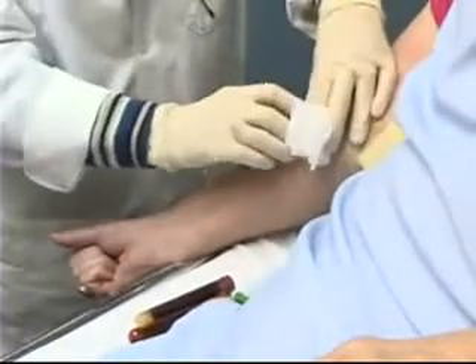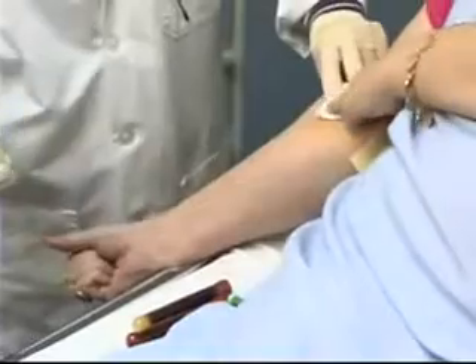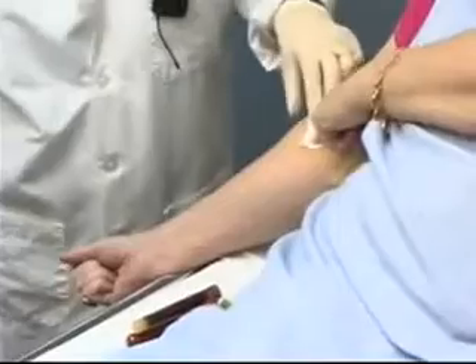I'll take my 2x2, put it over the site, and very quickly pull the needle from the vein. I can ask my patient to please put some pressure there.